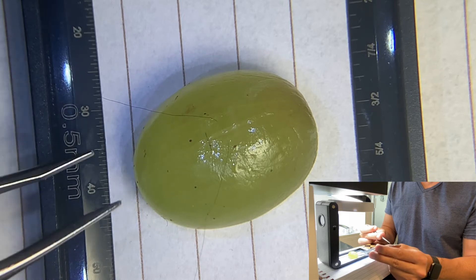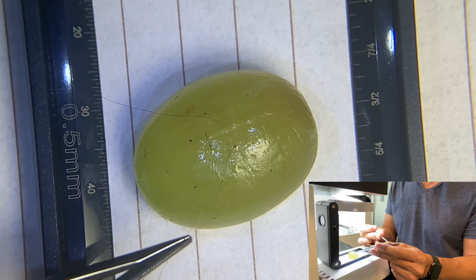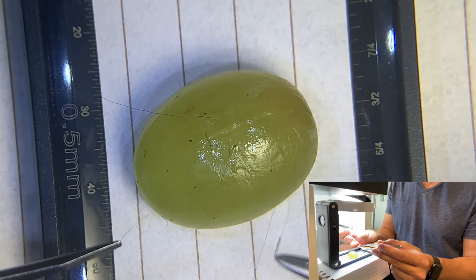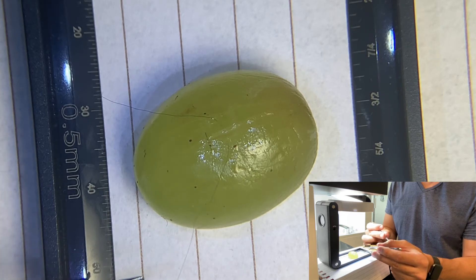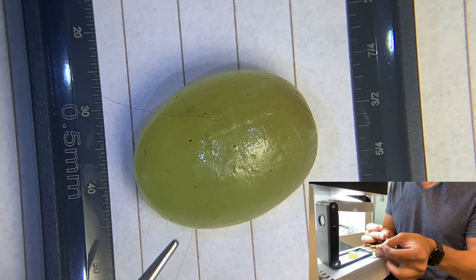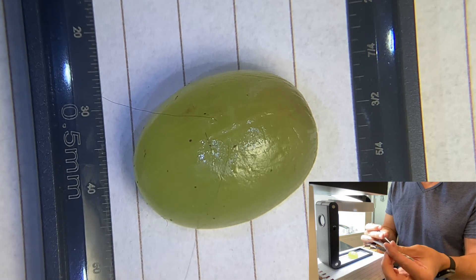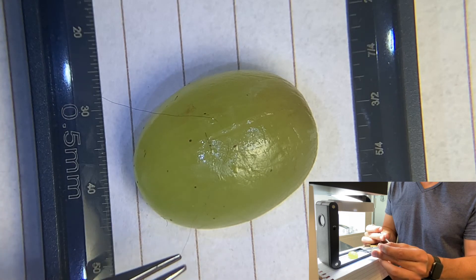Boom, you can see it now right there. So now I'm going to grab at the far periphery here and do what I call the handoff. I still have control of the needle — I'm not going to drop this and lose control until I have already made the handoff. I'm pulling it toward the left inner elbow, and you can see the suture's pointing off to the side in a straight line. I want to grab that at almost a parallel angle — the suture coming almost straight out of the tip of the second instrument.